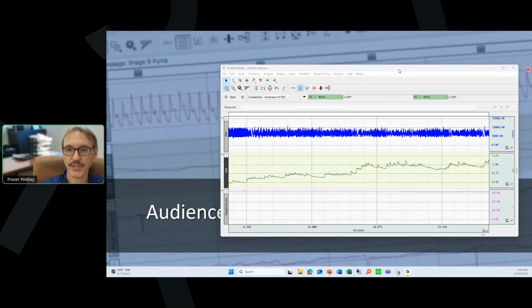So my recommendation is, when the participant first comes into the lab and you're setting everything up, the first thing to do is get the hands washed, or even before you're ready to start working with them, make sure their hands have been rinsed under the tap and dried thoroughly.